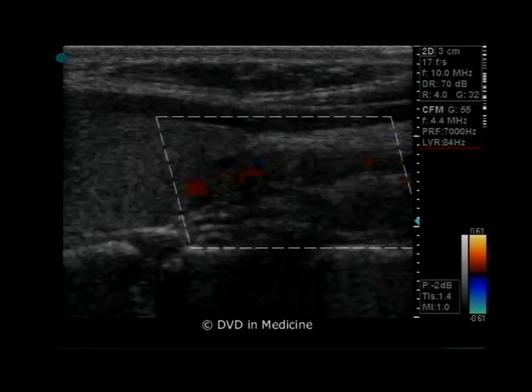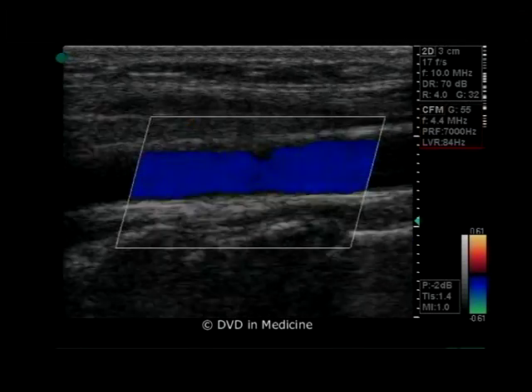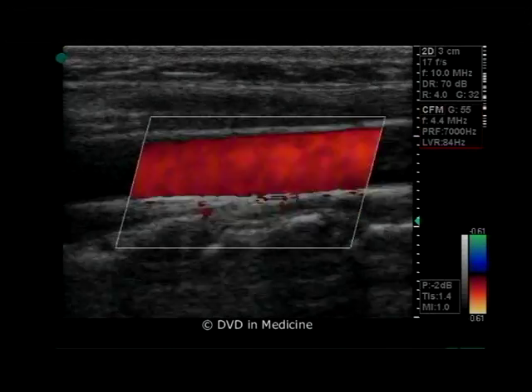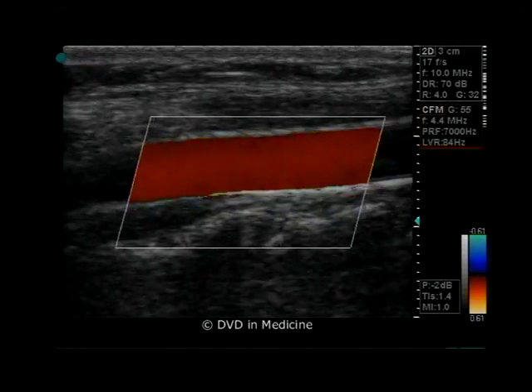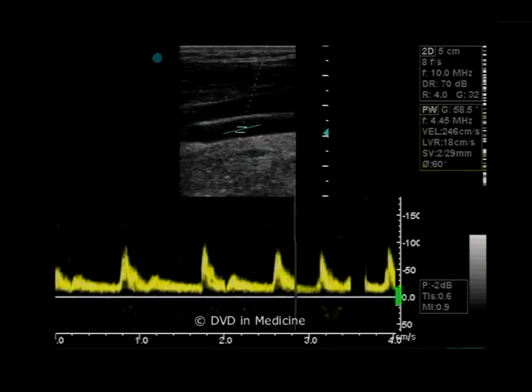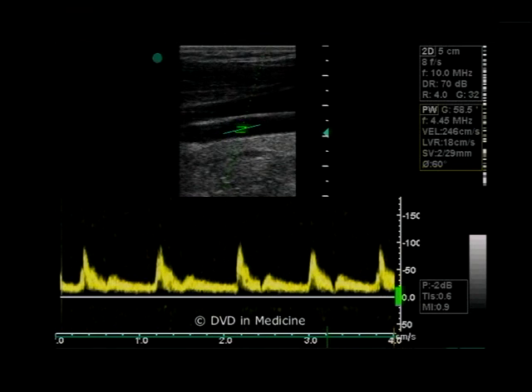One can then make an initial assessment of their significance and determine whether further spectral examination is necessary. It is also important to note that one can see areas of normal flow, and one can also take the peak velocity measurement in normal segments of the common carotid artery. This velocity will serve as the standard for comparison with spectrums taken from diseased segments.